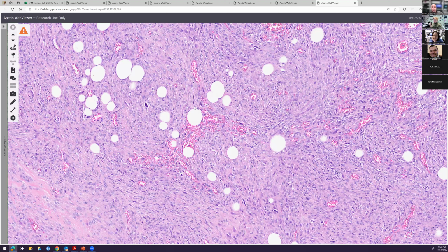You can see it with osteosarcomatous differentiation, rhabdomyosarcomatous differentiation, all that stuff, right? So not unusual, but most of the time it'll look like a high-grade pleomorphic undifferentiated sarcoma, right? Okay.